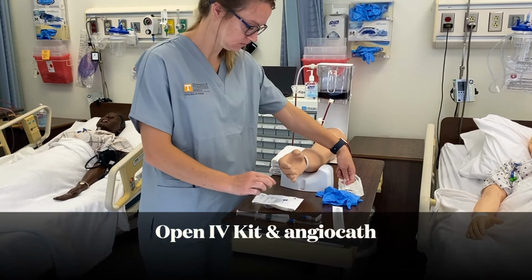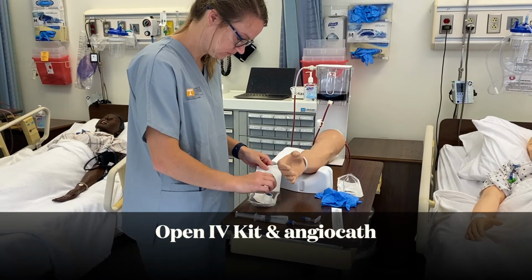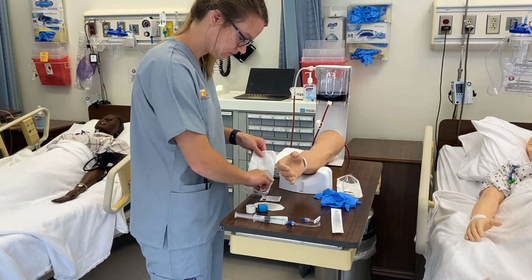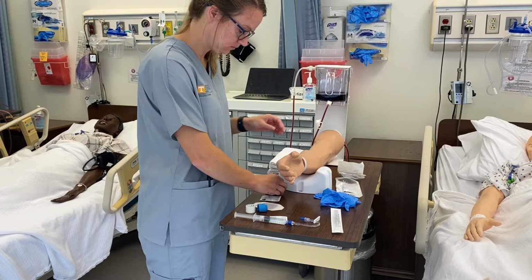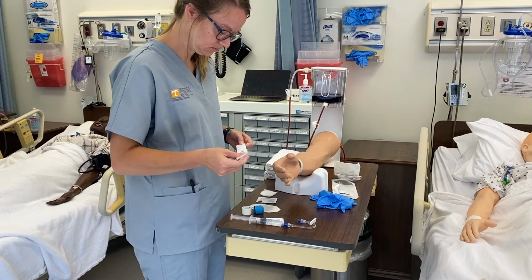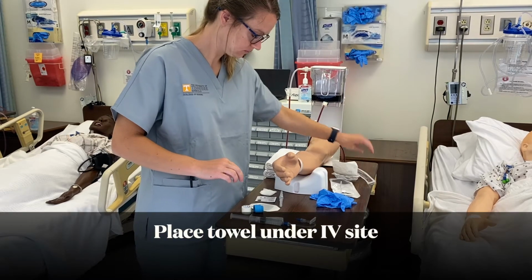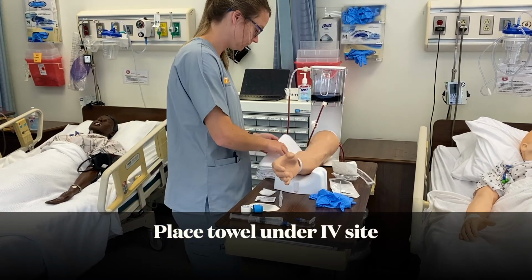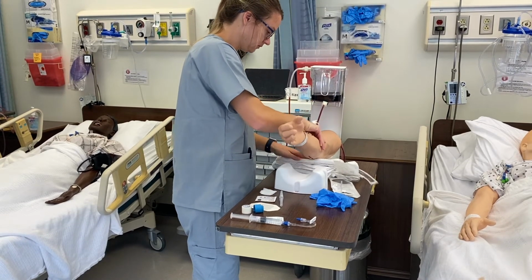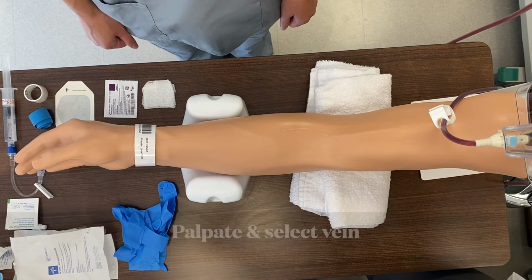Open IV kit. And open angiocath. Place clean towel under patient IV site. Palpate and select vein.